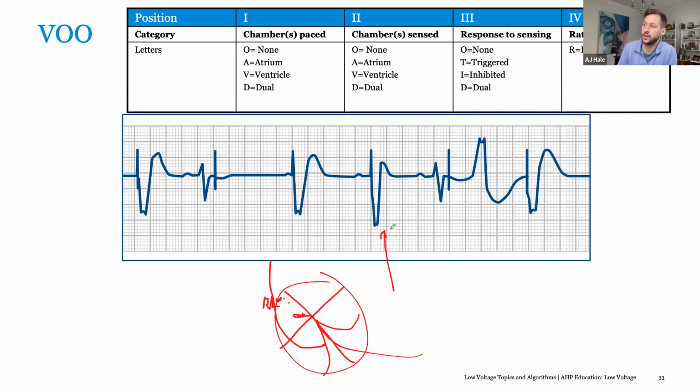our pacing activity. You may hear a term called pseudo-fusion. That just looks like we might have fused, but the complex will look exactly the same. Does anyone have any questions on that? I can belabor this point or move along if anyone doesn't have any questions. Please, you can belabor it, right? You can go ahead and explain, please. Okay, the difference between the pseudo and the fusion.